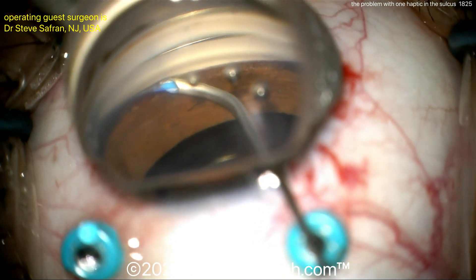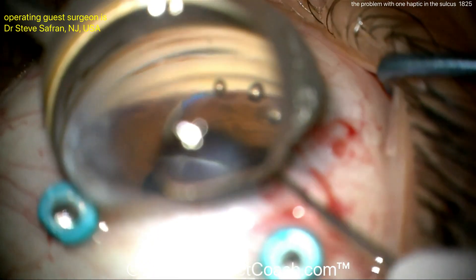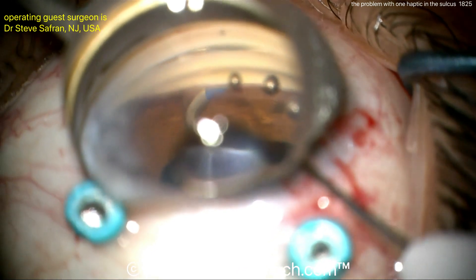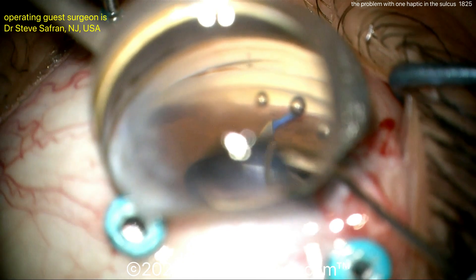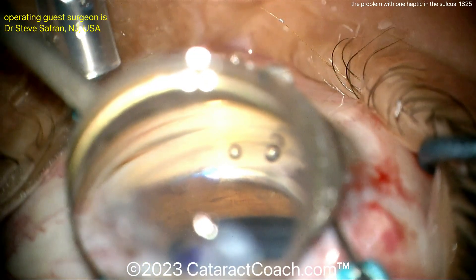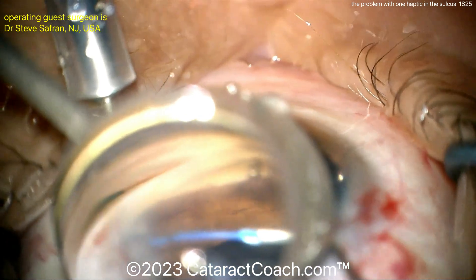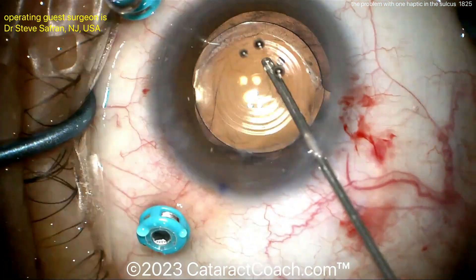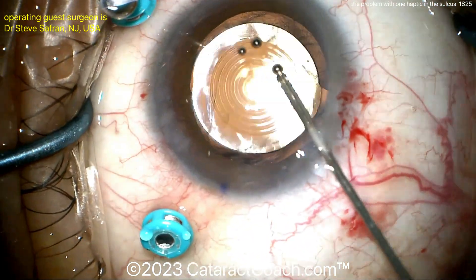And now the surgeon is going to do a gonioprism on the eye and perform a canaloplasty — injecting a little viscoelastic one way and now the other way — and perhaps a goniotomy too. So maybe this patient has some pressure-related issues, and this will help control that glaucoma. So goniotomy plus canaloplasty, plus pars plana vitrectomy, plus IOL repositioning — this is quite an involved case here.